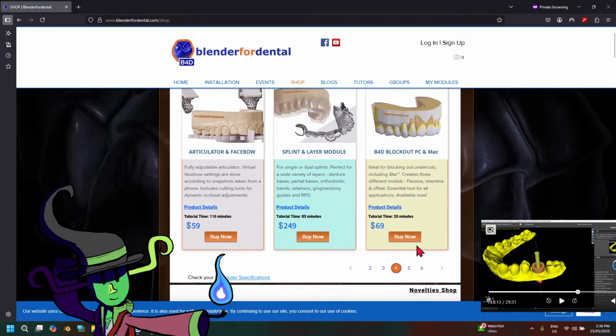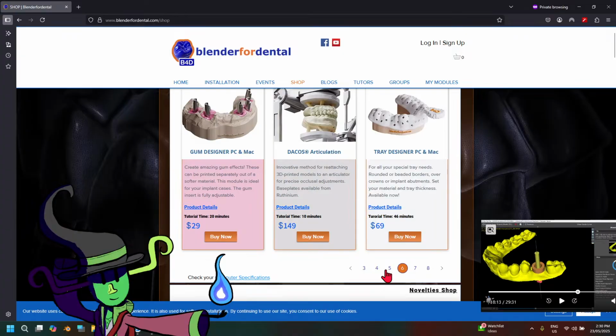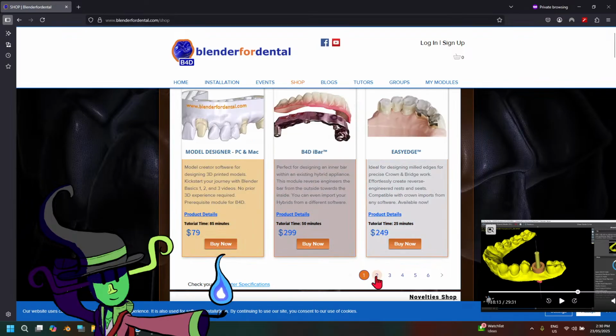despite the amount you will pay for each module here, it's only a one-time fee. And once you pay for it once, you don't need to pay for it again. That includes all the exporting you'll do in the program.